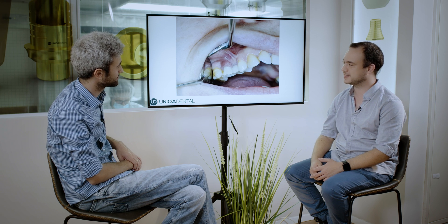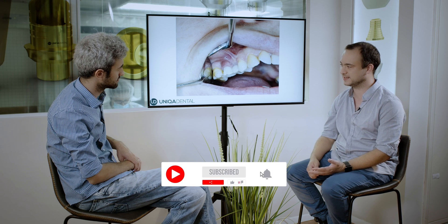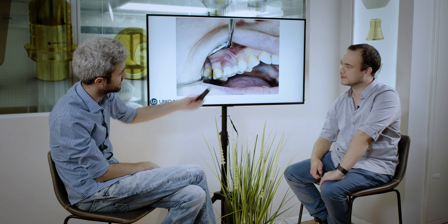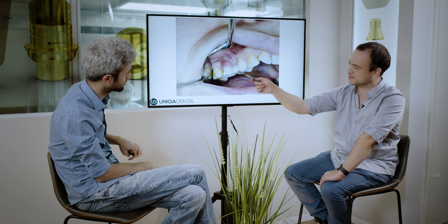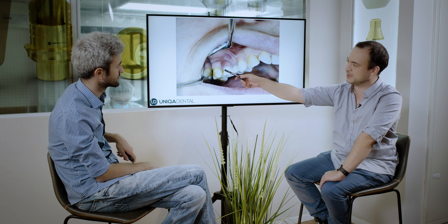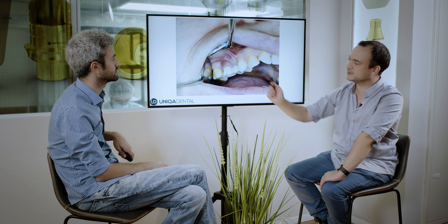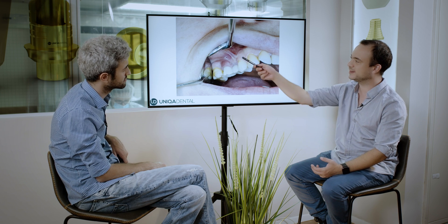Today I want to show some information around implants, around the crowns, and how you need to maintain them as a dentist. You take the crown, clean, do everything around these crowns. In these two crowns, you can see it's a bridge of two implants. You can see the inflammation in the gingiva — it's swollen a little bit. The color is red, it's not pinkish like healthy gingiva.